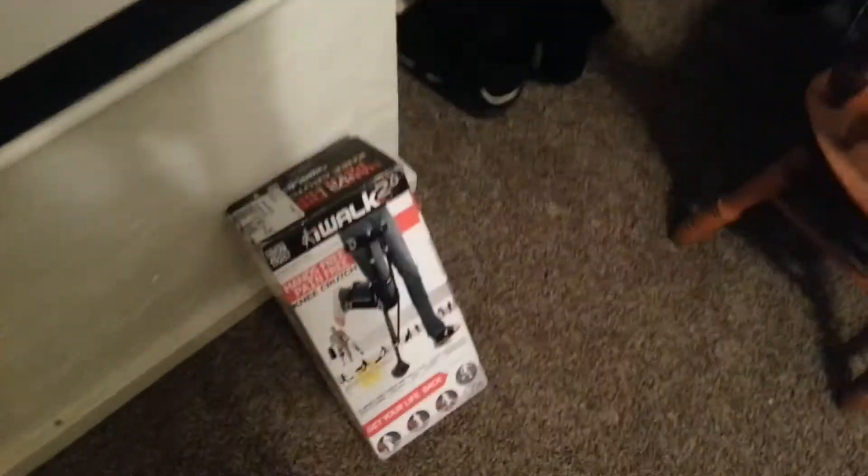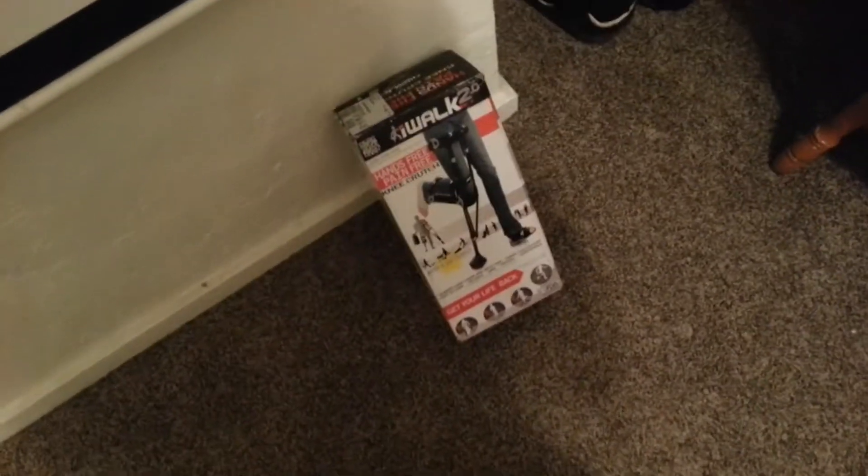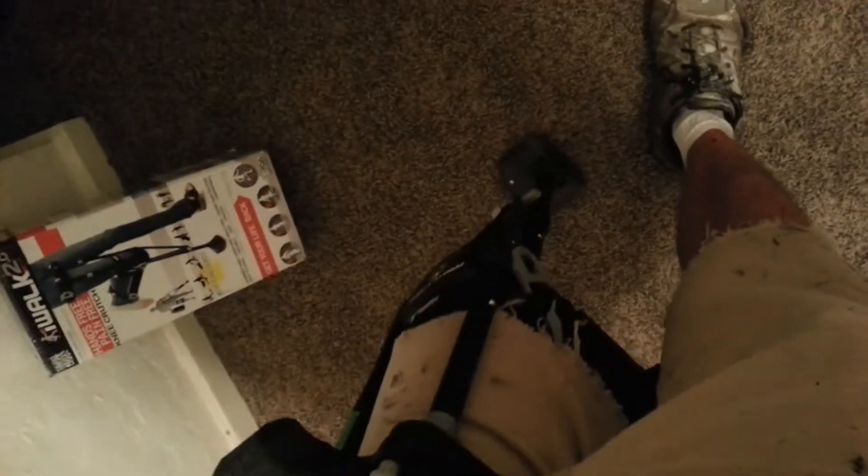So I got this, and nobody's even seen one, including at the hospital — they're like, where'd you get that thing? I think it's definitely a conversation starter pretty much wherever you go. I'm wearing it right now, don't mind the work clothes. It's pretty stable. It still sucks because you don't have the use of your foot or your knee when you're using this thing, but it's still a really good alternative to crutches.